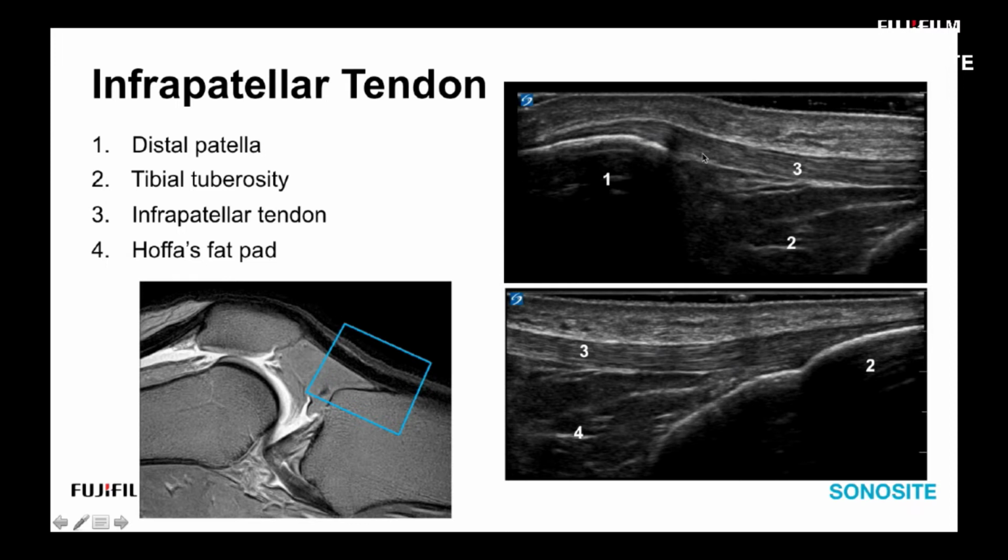A little trivial question here: why do we call this a tendon if it appears to go from bone patella to bone tibia? It just depends, I guess, on how you were brought up, tomato tomato kind of thing, or how you were taught. But some schools of thought would consider the patella a sesamoid, and that would make this an extension of the quadriceps tendon. So we have the patellar tendon just being an extension of the quad, which is enveloping the patella as a sesamoid, classifying the rest of this structure as a tendon.